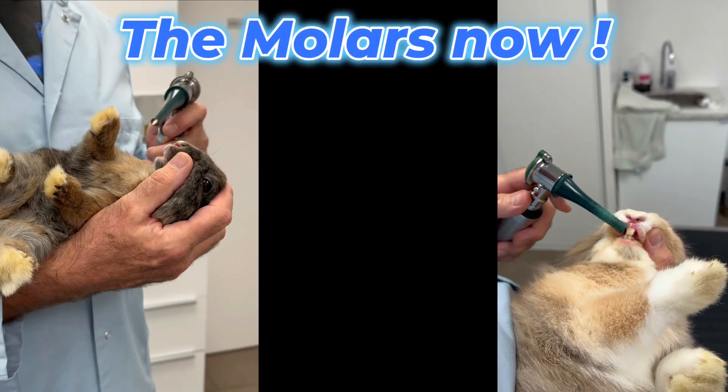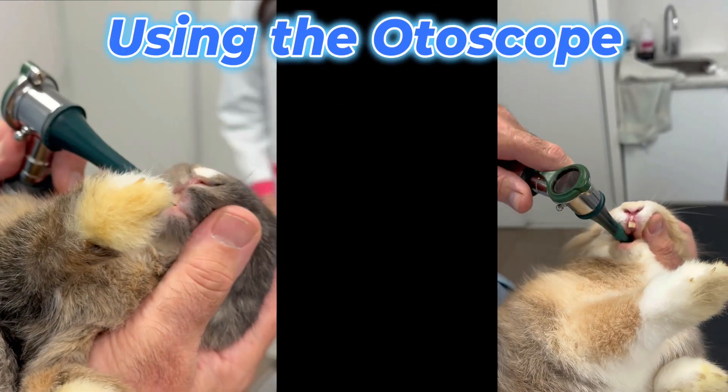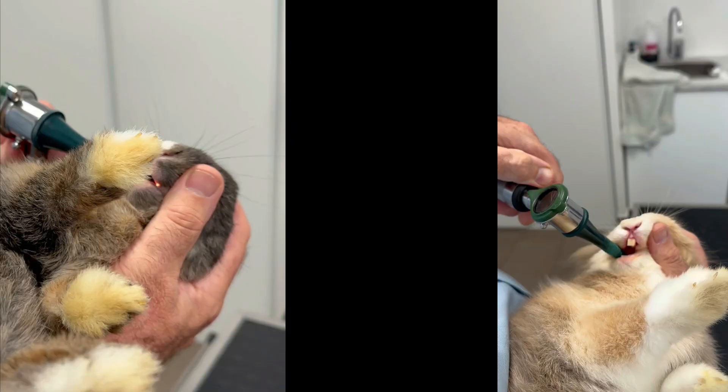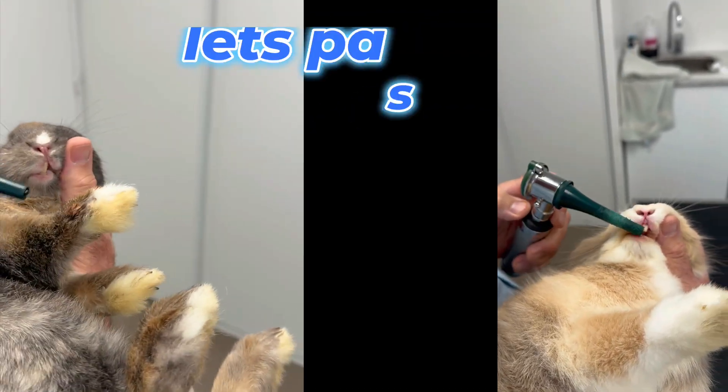Then we turn the otoscope light on and we're moving over to the side. We're looking at the jugal teeth — molars and premolars.